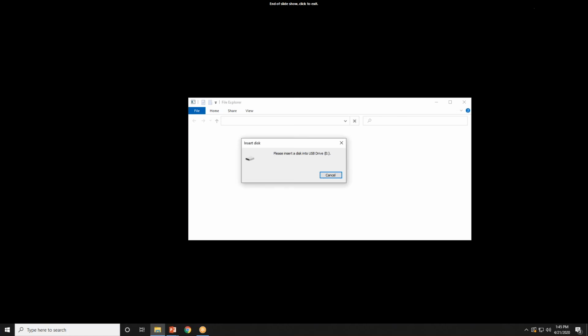If you're 90, we'll go back to the Doppler equation. If you're 90 degrees, the cosine of 90 is 0, you can't solve that equation. So you cannot tell. You have to flip the transducer and look in a longitudinal plane. That would have been a good test question. Thank you.